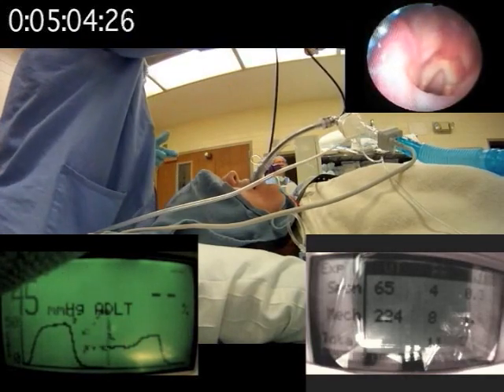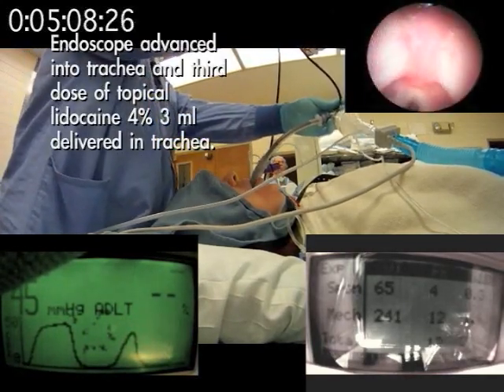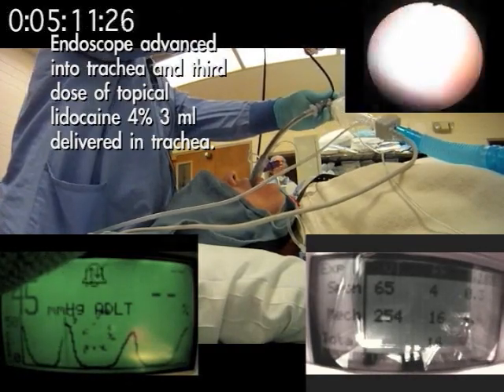Next I'm going to go into the trachea and put the scope in there and squirt it again. Ready? One, two, three — over the top. There we go. We're in our trachea.